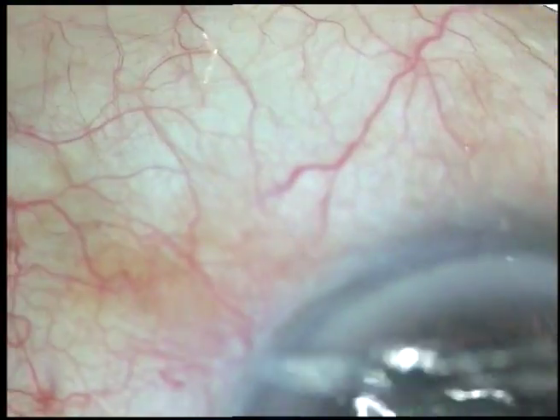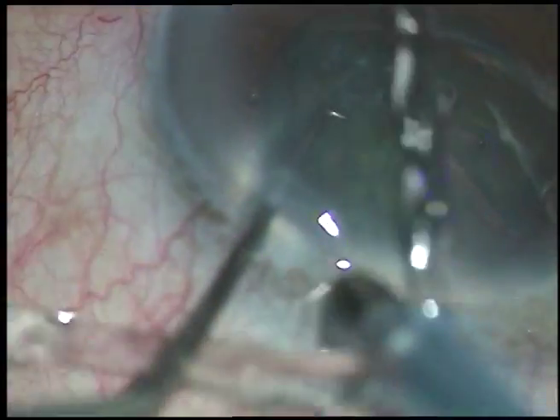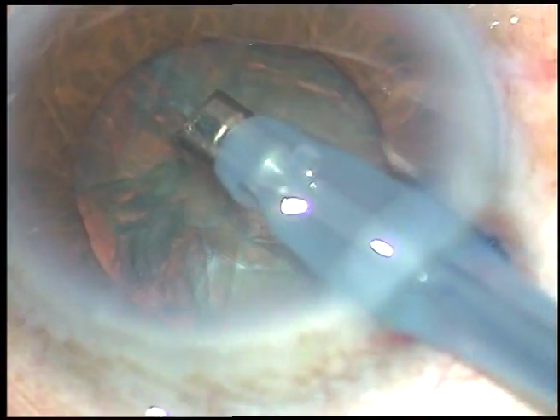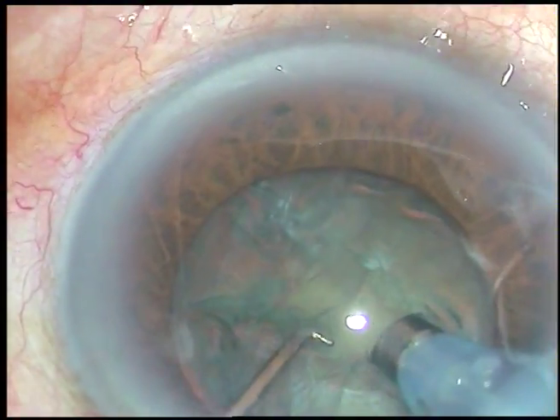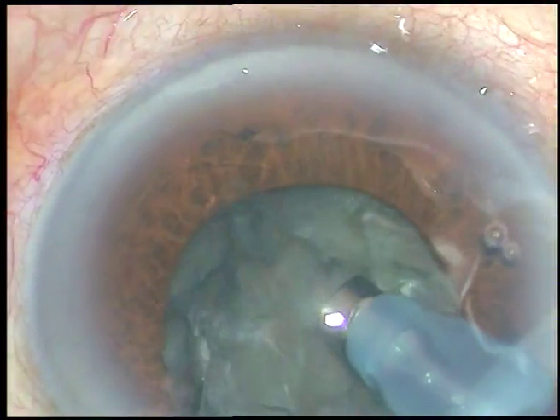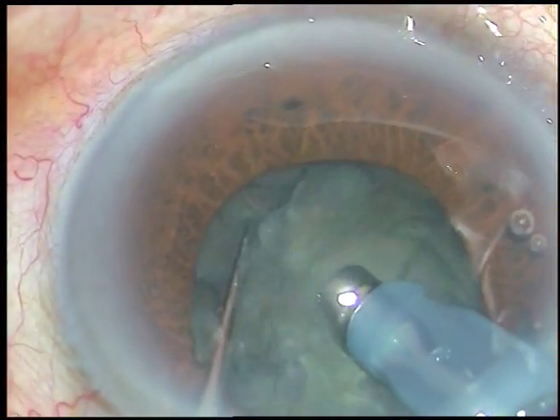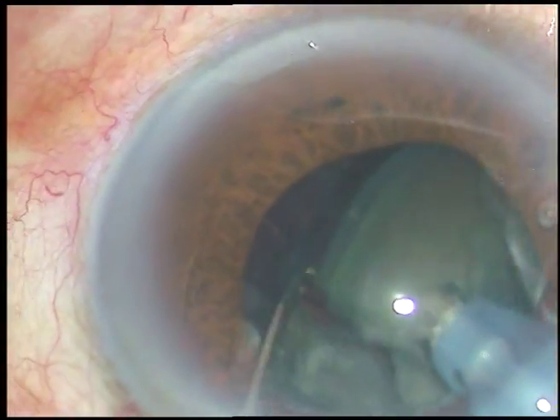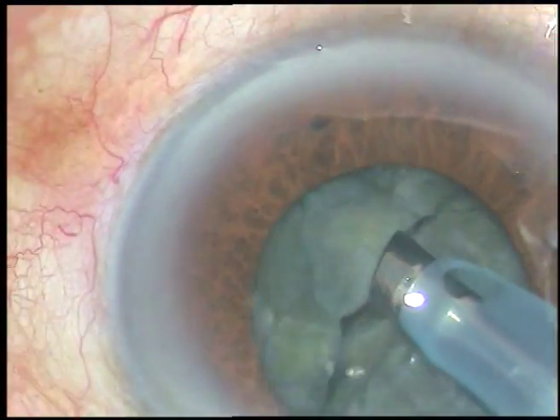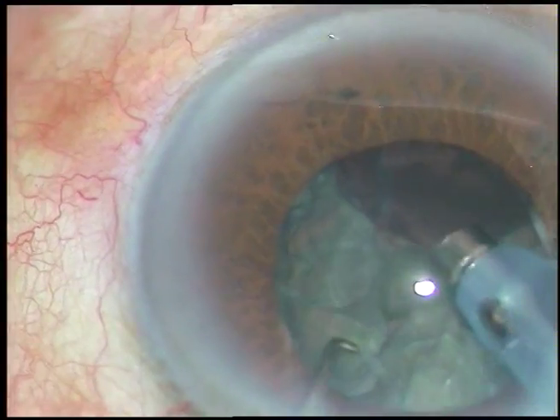So it is going to be a play between a cat and a rat. In this case, I have planned a direct chop. It is a grade 2 nuclear sclerosis — I will not be able to hold it firmly. So I engage and rest there with very minimal vacuum to make the nucleus stable, then chop it. I bury the tip, stay there, and chop. I do not apply much vacuum to hold the nucleus; if I apply much vacuum, a piece of nucleus will just come off and I will not be able to hold it.